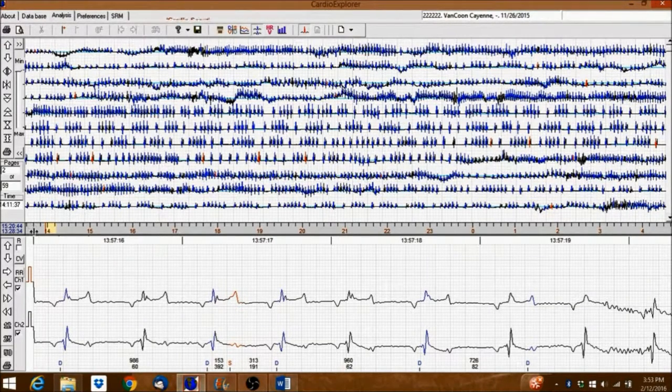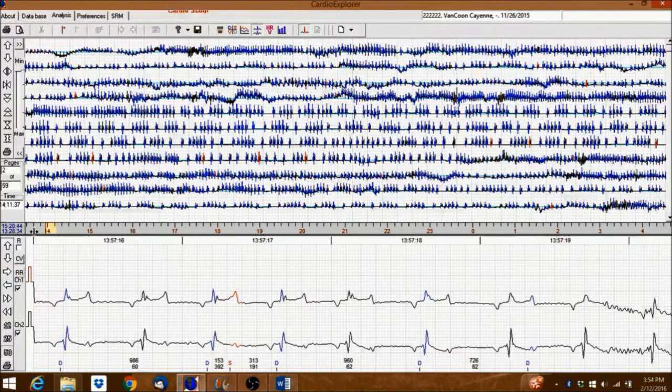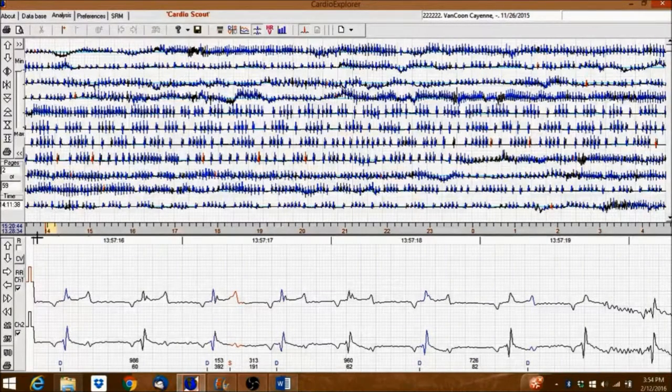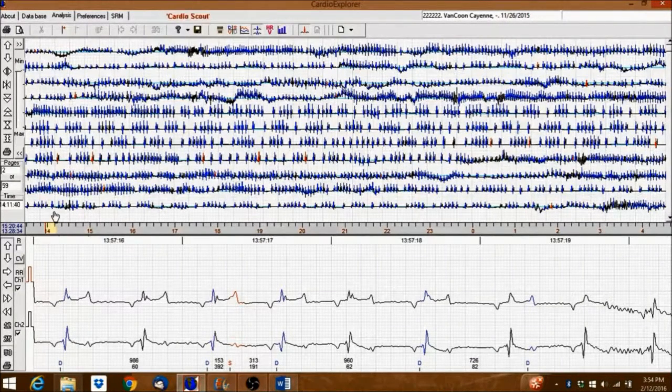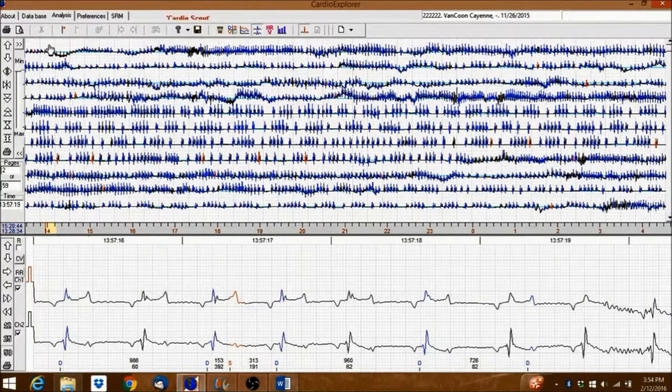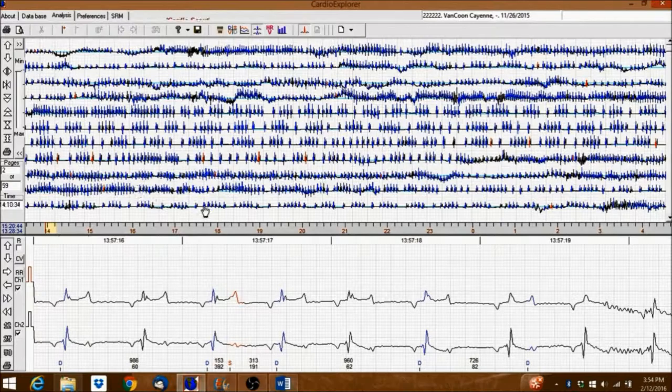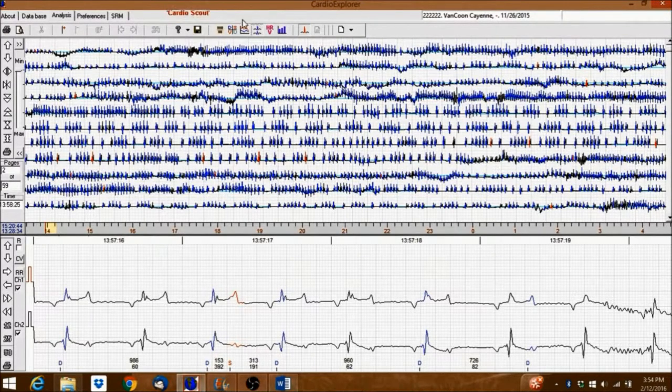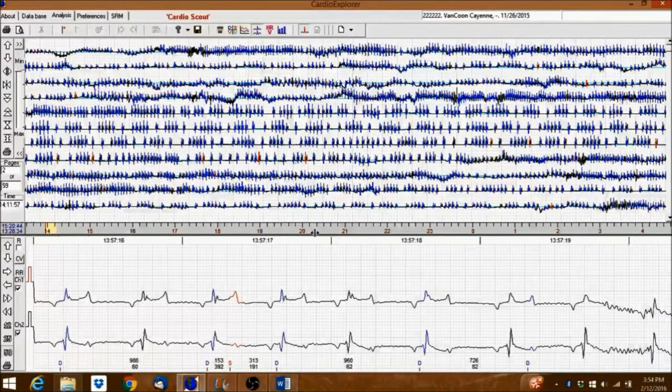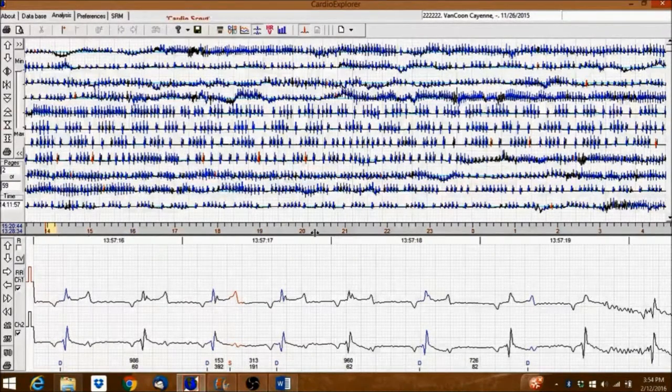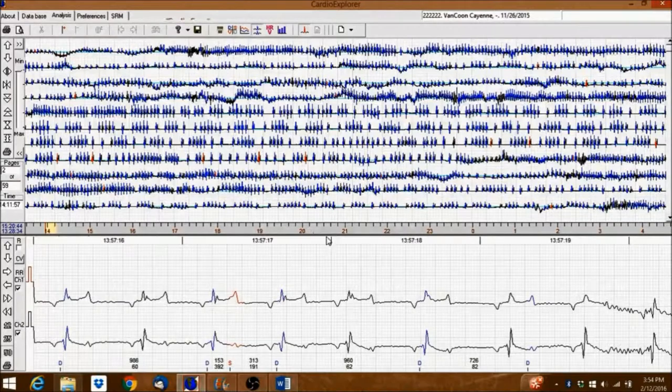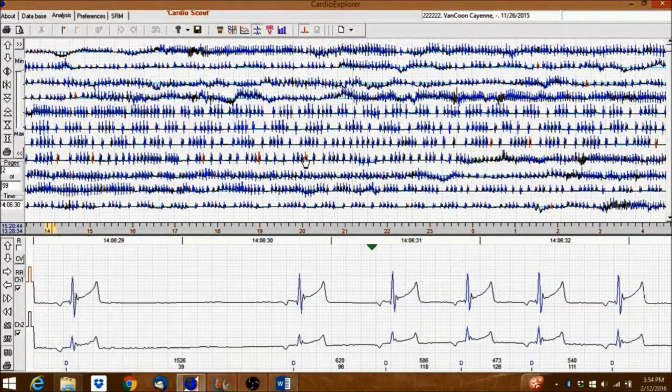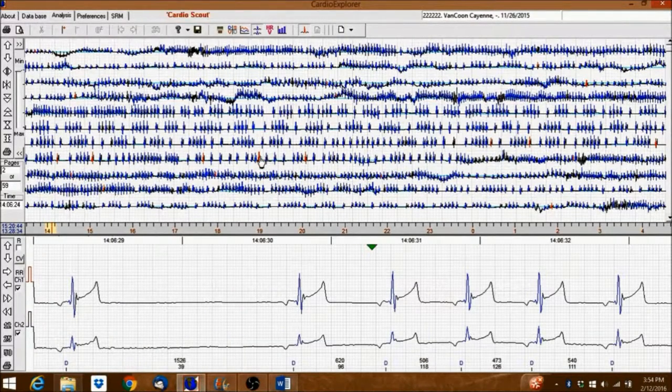The yellow highlighted area inside the time bar corresponds to a section of ECG strip in the upper half of the screen. Clicking anywhere into the Full Disclosure window will move the signal to the corresponding position below.